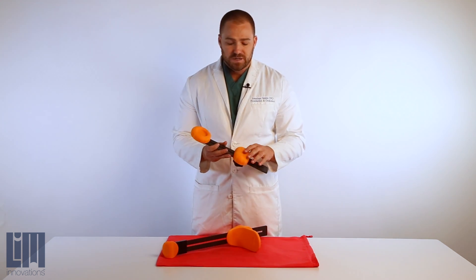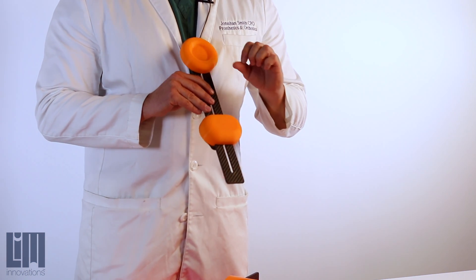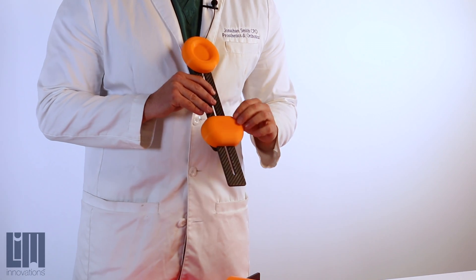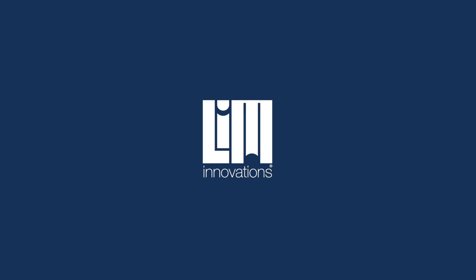Down at the bottom, the femoral paddle will give us a slight indentation that will show us the depth we need to go into the femur for distal lateral femoral stabilization.